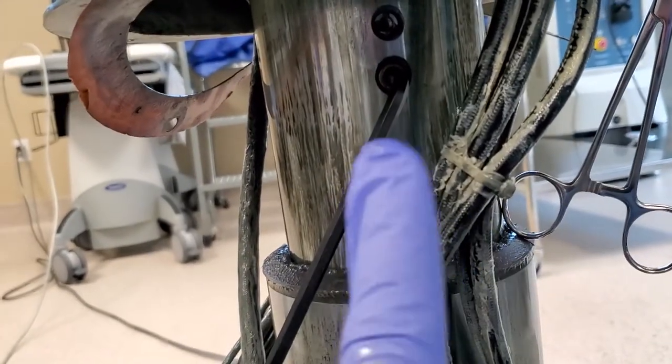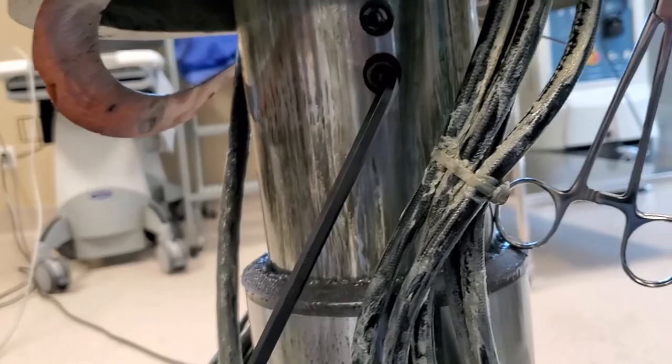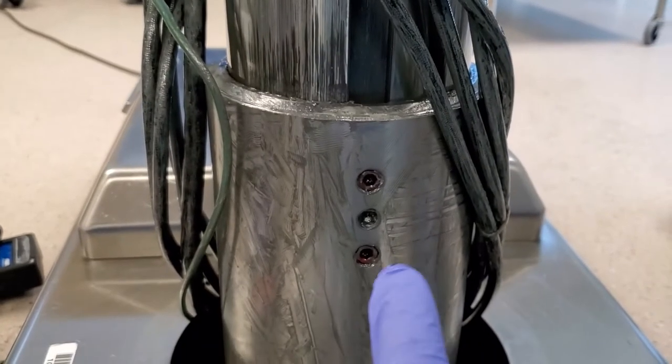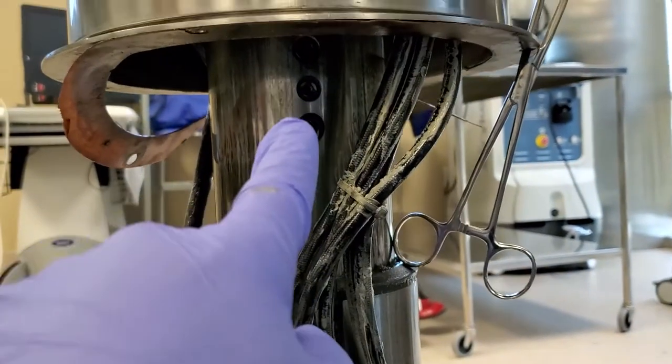Do not pull both fasteners out at the same time. One at a time, clean it, Loctite it, put it in, and pull the other one out. And this one down here is tight, so I don't have to worry about that one. That one up there is a troublemaker.